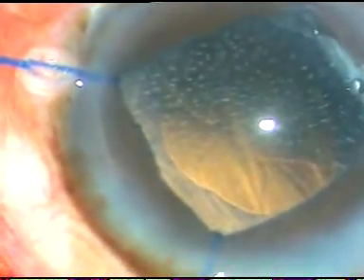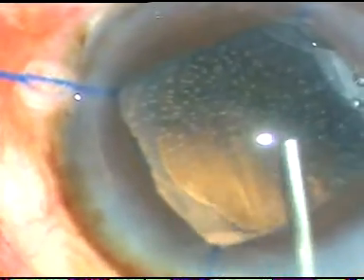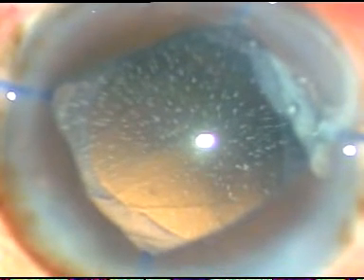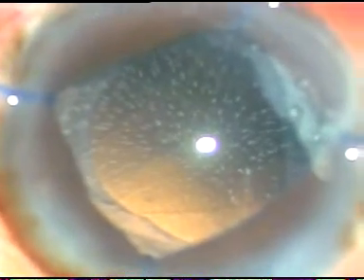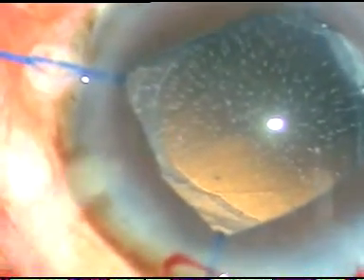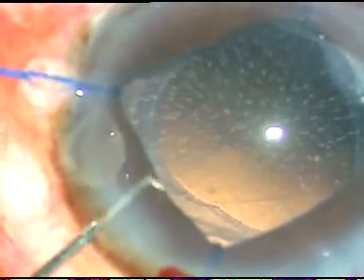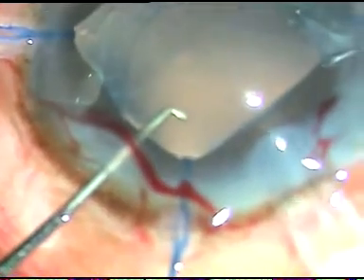Now I have to implant an intraocular lens. Since I need to remove the hooks, I implant it under viscoelastic substance. I am going to implant the lens. I have to be very gentle while I implant the lens. I must not push the iris and cause iridodialysis.